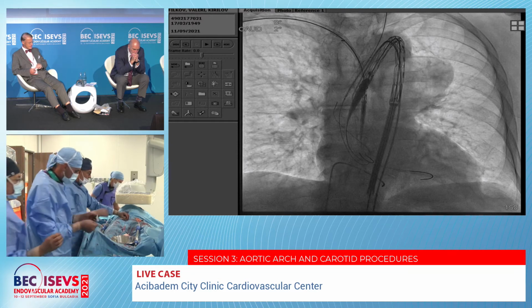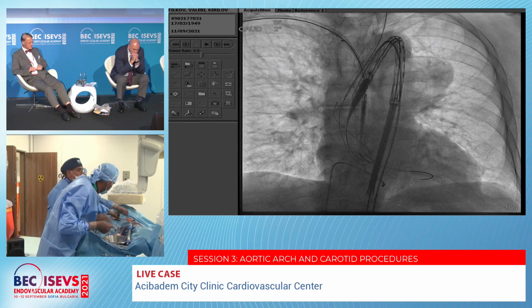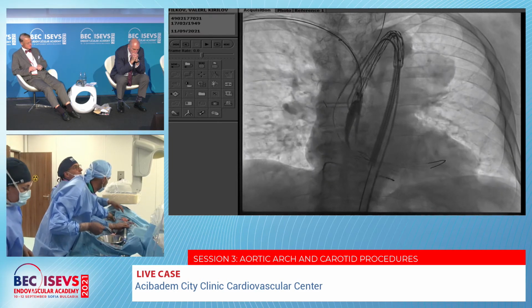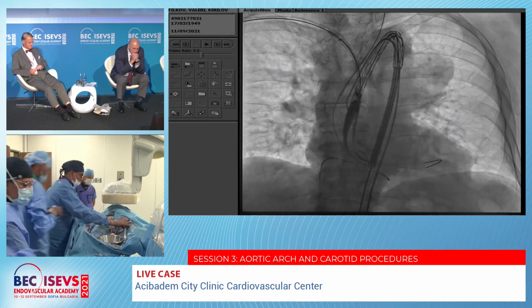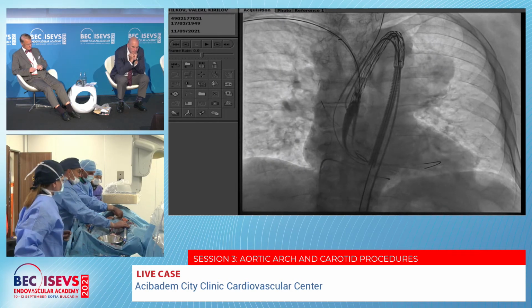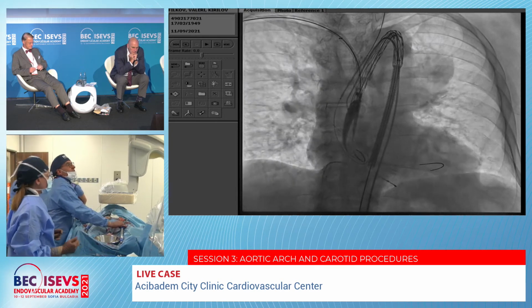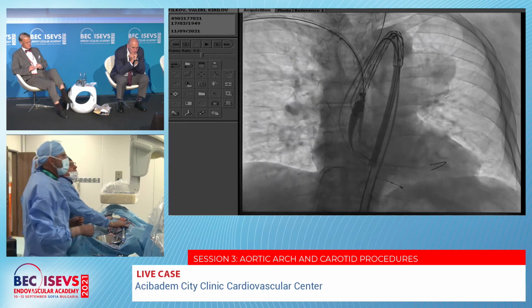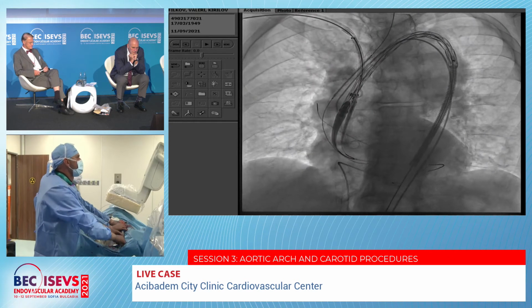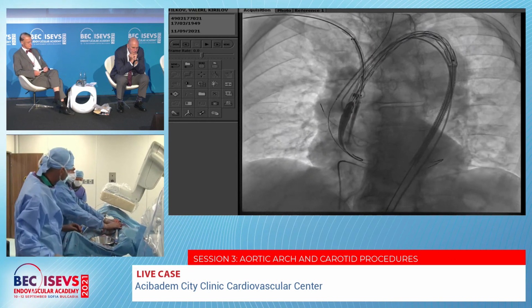I have the impression that the aortic endograft moved a little bit back. Is that true or not? You're absolutely right. And because of that, we are putting the pacemaker now gently on 120 to have some reduction before going for total opening. Yes, going to the left. It's great. I think it's not bad.